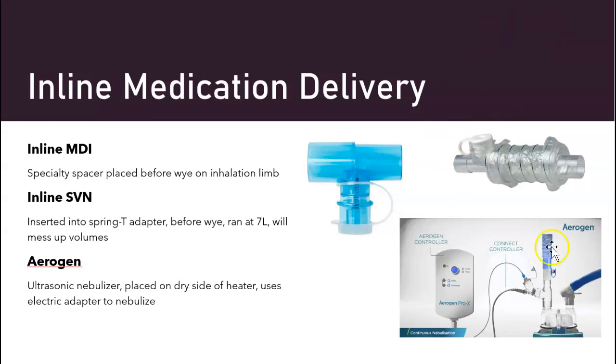It's lovely. They're new, they're beautiful. And so then you can find what little port fits your medication that you're giving, whether it be a bronchodilator or an inhaled corticosteroid. Most of the time I've given inhaled corticosteroids through inline MDIs, like a Pulmicort or Symbicort or a Dulera, something like that.